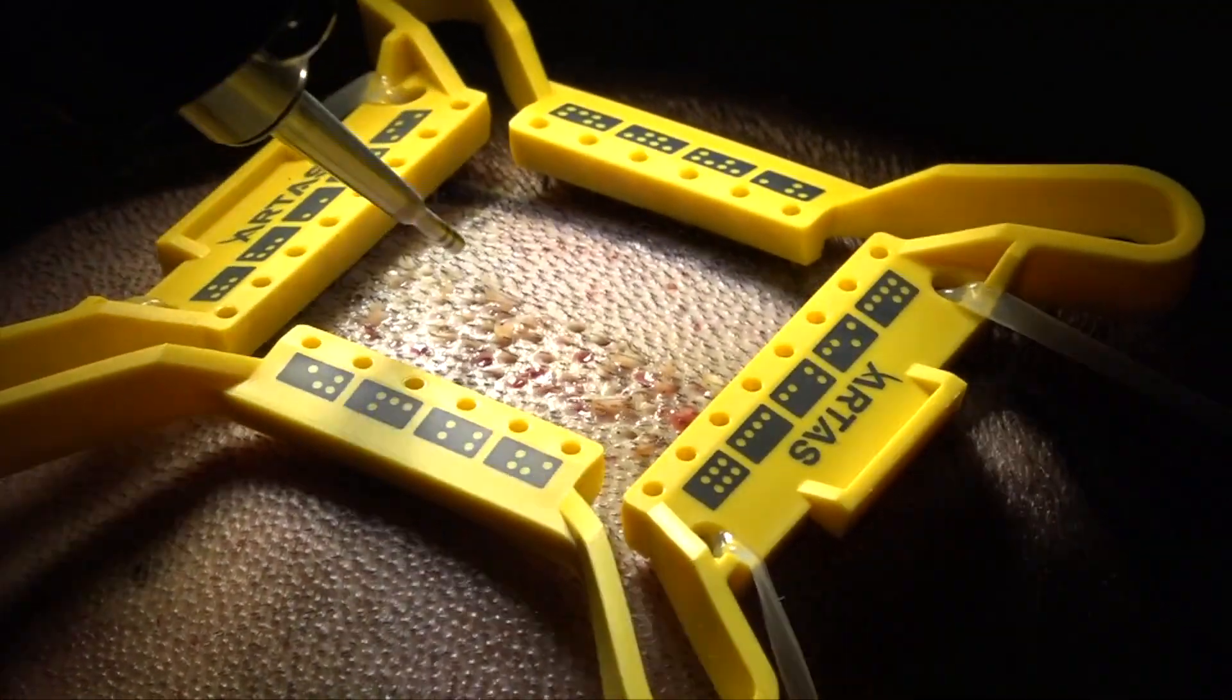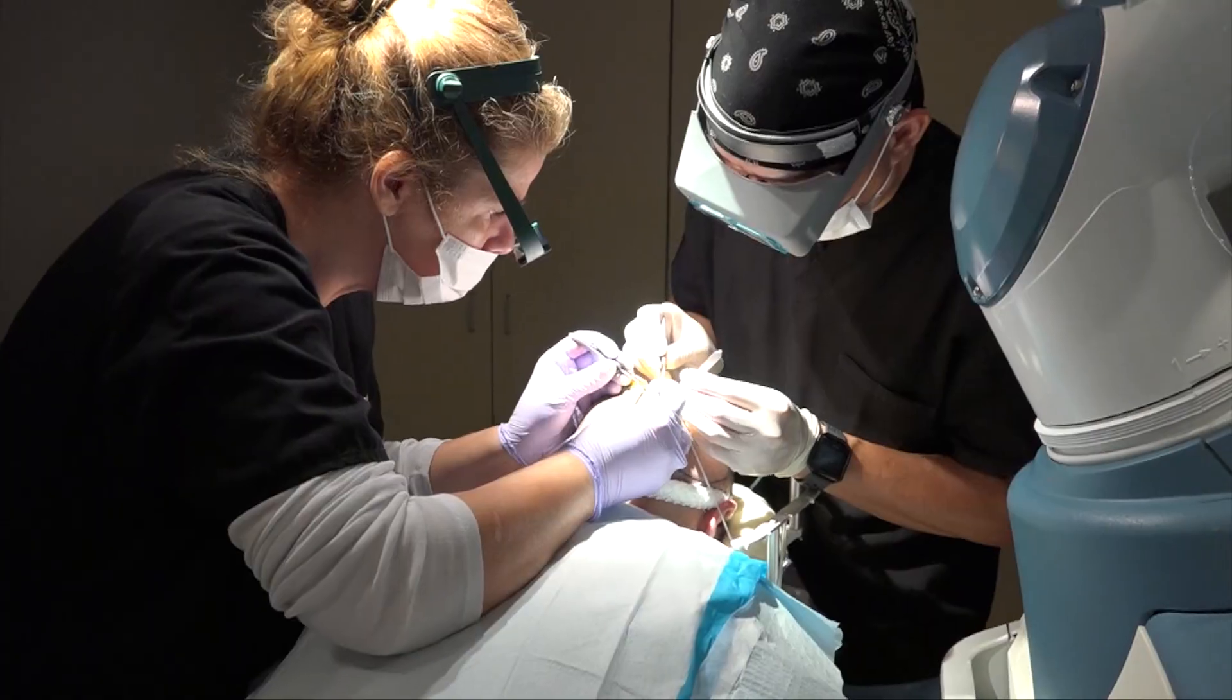We're getting beautiful grafts, extremely accurate, no transection. This is a great case.